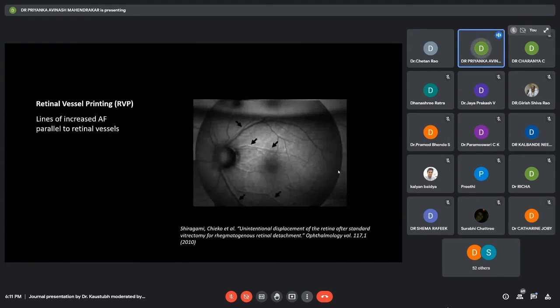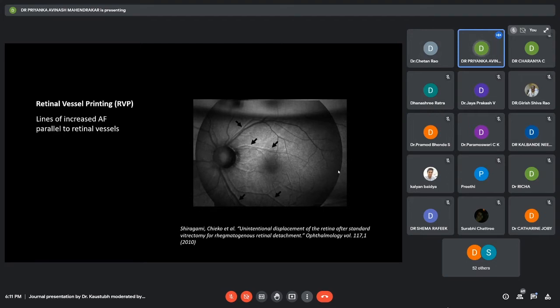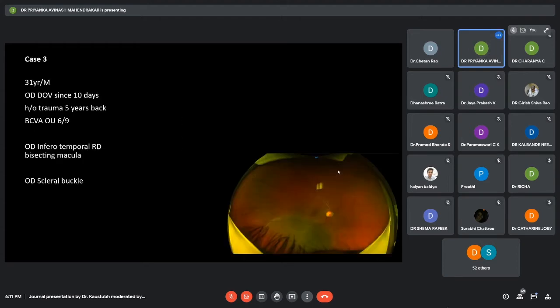The second differential is the retinal vessel printing, which are lines of increased autofluorescence which can be seen parallel to the retinal vessels. These were first seen by Shiragami et al. in 2010.